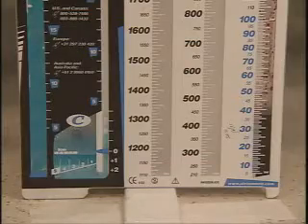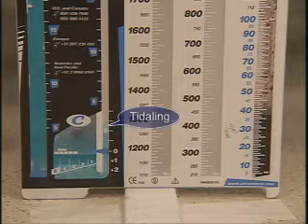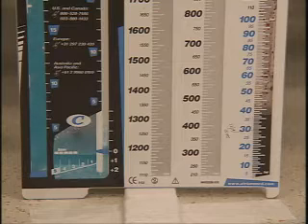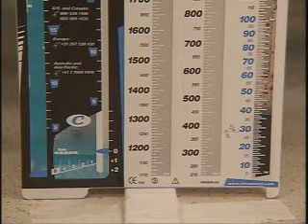Regularly check the water seal chamber for tidaling. The water level normally rises and falls with respiration. During inhalation, the pressure in the pleural space becomes more negative, raising the water level in the chamber. During exhalation, the pressure returns to baseline, and so does the water level in the chamber.